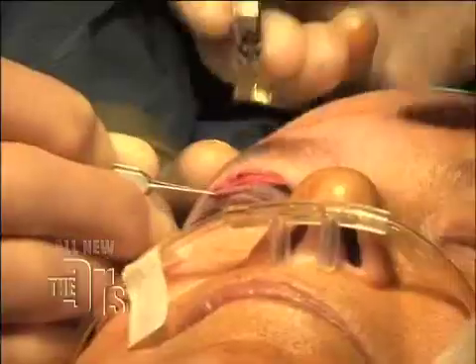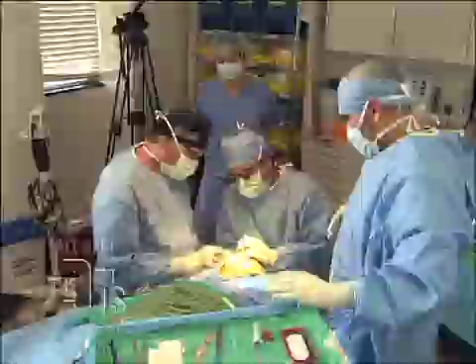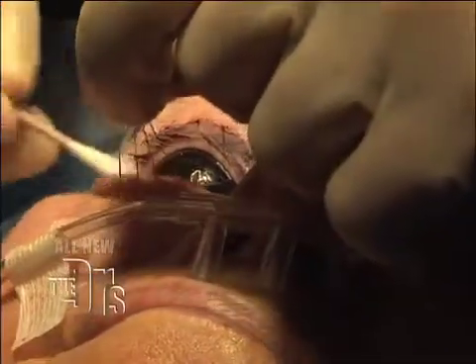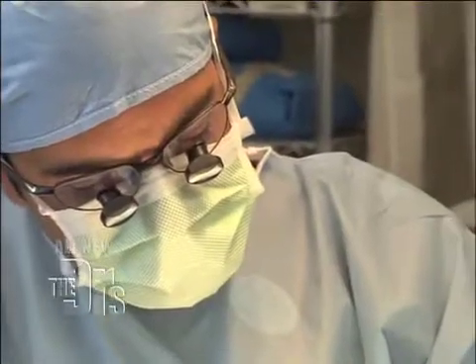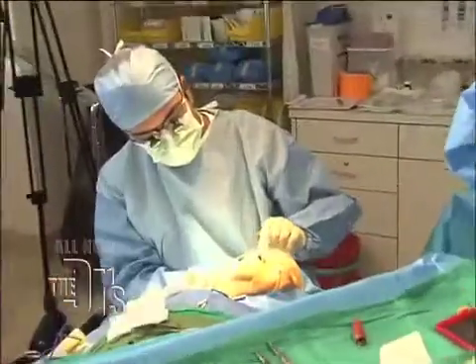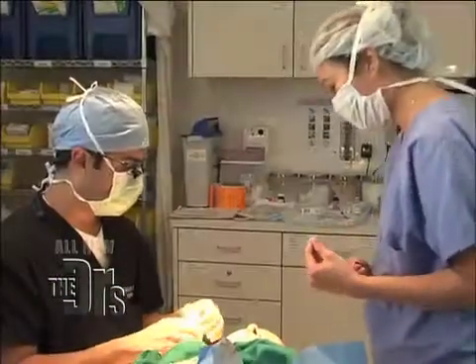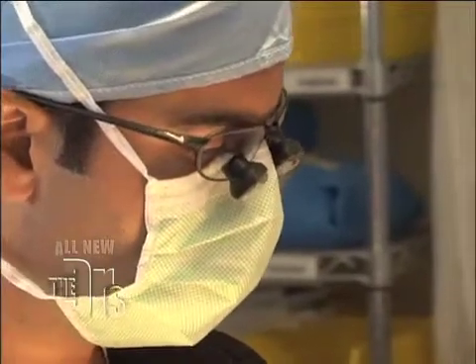The gold weight goes right in that pocket. We're going to tack it down with some micro sutures. We're putting multiple sutures on the lower eyelid to allow the eyelid to hug the eyeball so it stays in place. I'm just closing the corner of the eyelid. We just put the last stitch on and she's going to do great. I think she's going to be very pleased with the result of this.